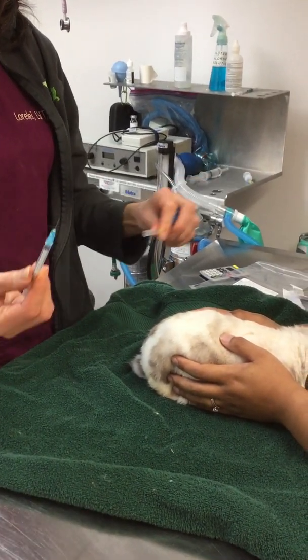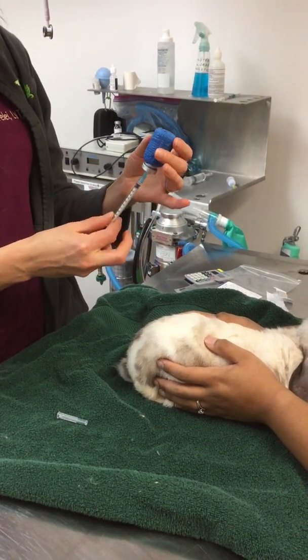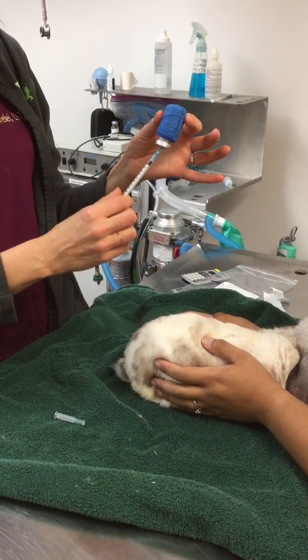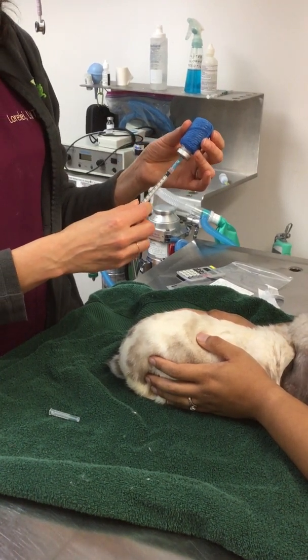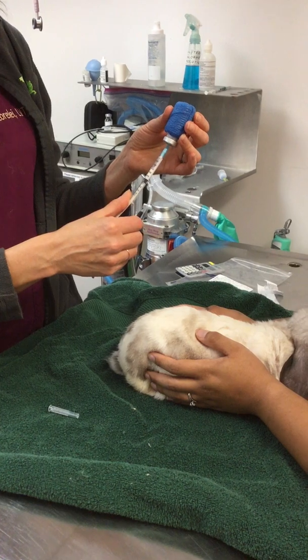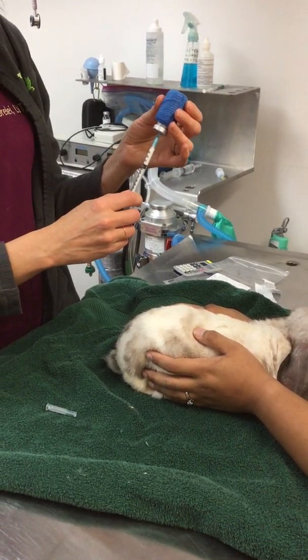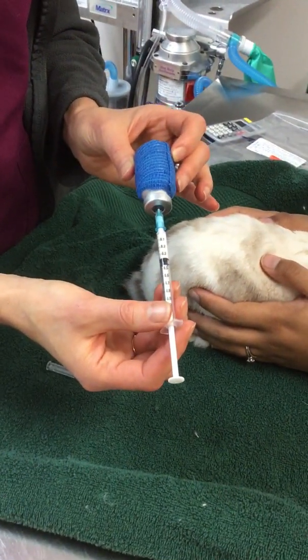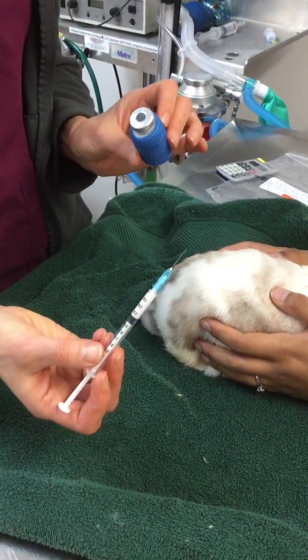You're going to take the needle and inject a little bit of air so that the pressure inside the bottle is even. Then I'm going to draw back the amount that I need — so I need 0.35 mils. You can see here it's right between the 0.3 and the 0.4. And I'm just going to pull my needle straight out of the rubber hub.